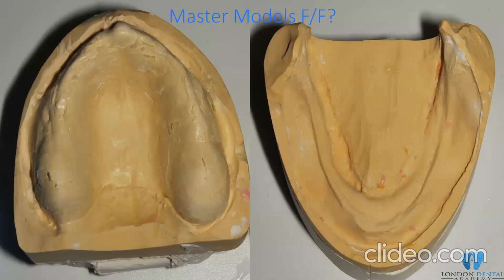Casting the models, as you can see, upper and lower, we have got nice ridges. As you can see, massive tuberosity on the right and left-hand sides. And this is the area, you can see when you finish, almost 2 millimeters of the fovea palatini, and also behind the hamular notches. Keep it extended to the hamular notch. Don't underextend it. I know it's massive, but I keep it that way, it is much better rather than underextend it. So I try to get the best extension possible rather than trim at an early stage.